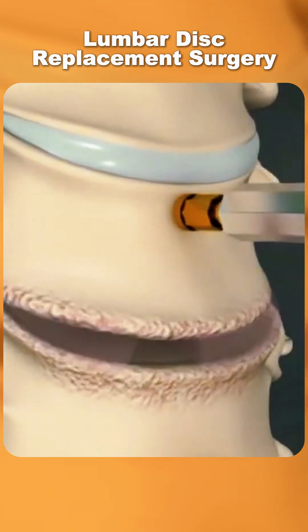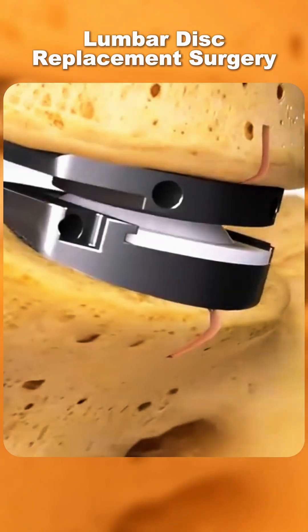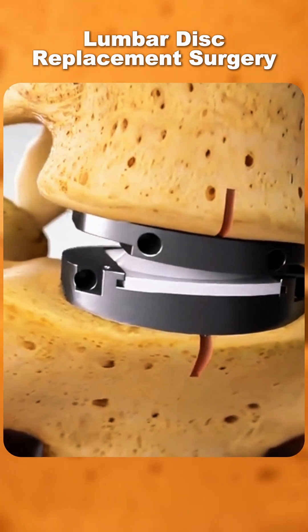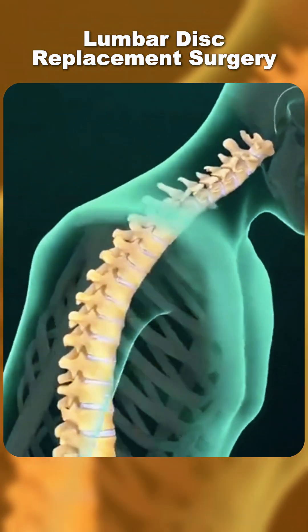During surgery, the damaged disc is carefully removed. In its place, a specially designed artificial disc is inserted. This implant mimics the natural movement of a healthy disc, allowing the spine to bend, twist, and flex normally.